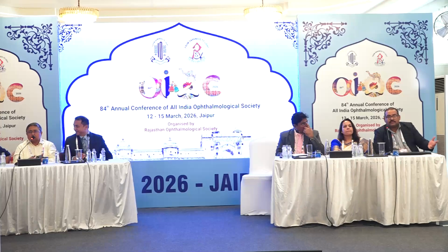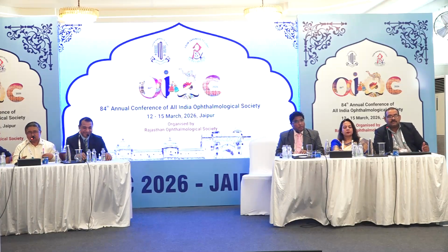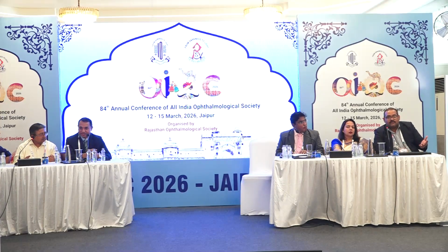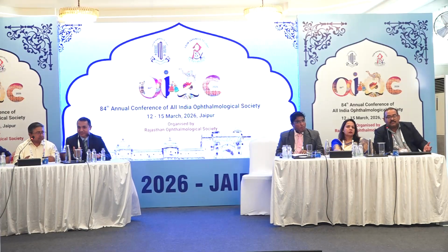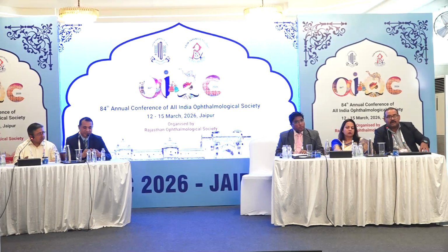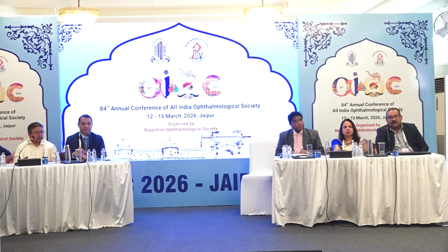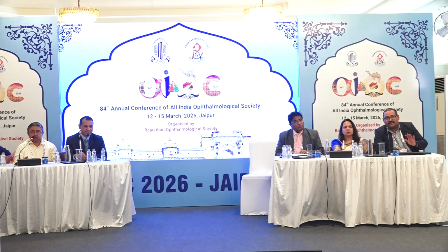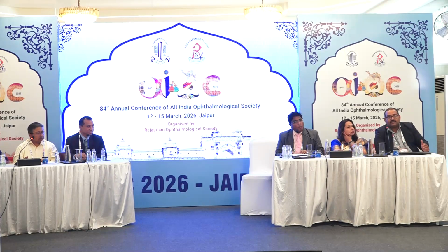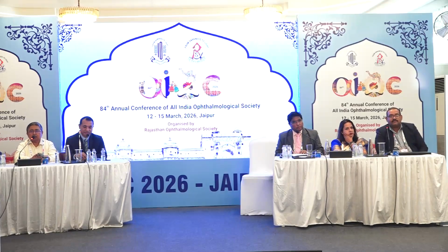I don't know whether that's a very dicey situation. See, Hill-RBF or Barrett is applicable worldwide because it's under the assumption that the eye does not grow for a person who is 50 years of age. But in a child, if the longitudinal progression and variability are not accounted for in the training part, it will not be accurate. So ideally, I would still be very, very skeptical about AI use in children, especially. Retinal images are a whole different ball game because the picture is more or less the same.